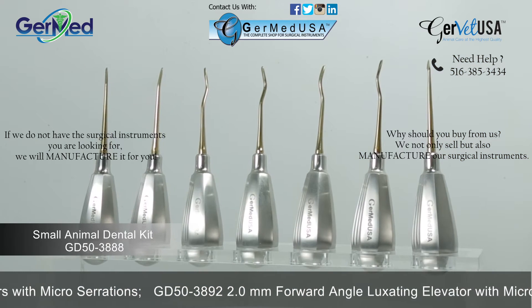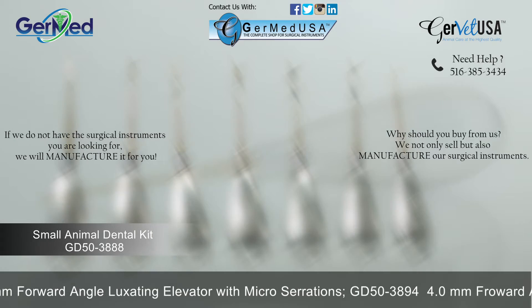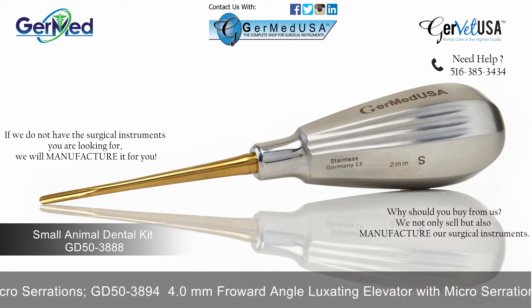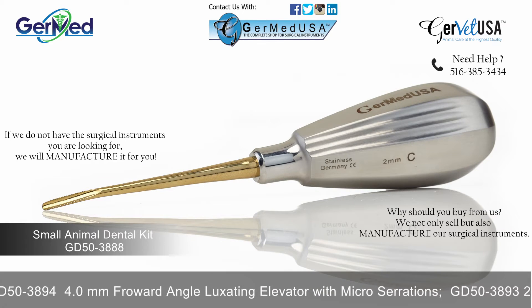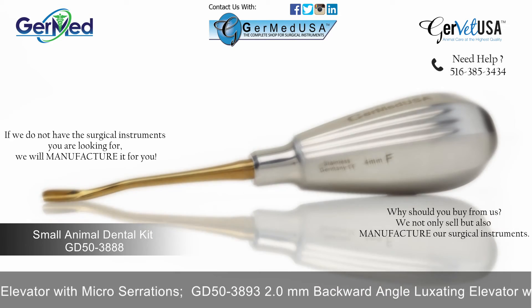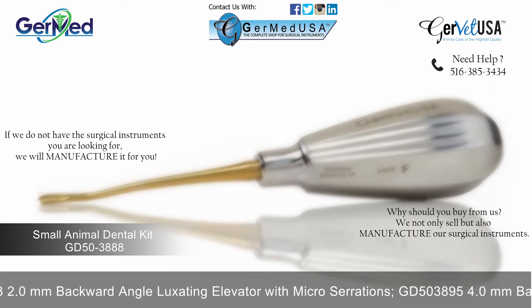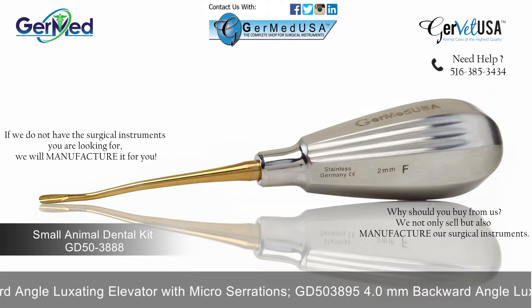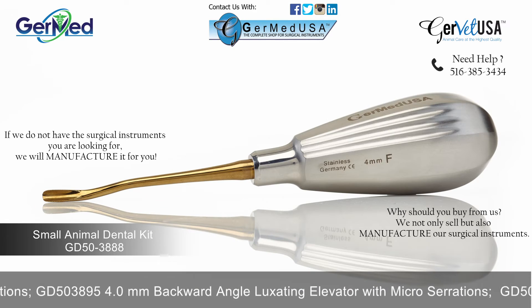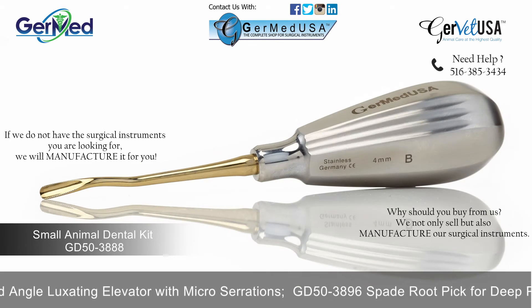A set of seven luxating elevators with micro serrations to separate the PDL. This set includes two luxating elevators with micro serrations which measure in two millimeters — one in straight, the other in curved — two forward angle luxating elevators with micro serrations measuring in two millimeters and four millimeters, and two backward angle luxating elevators with micro serrations measuring in two millimeters and four millimeters.